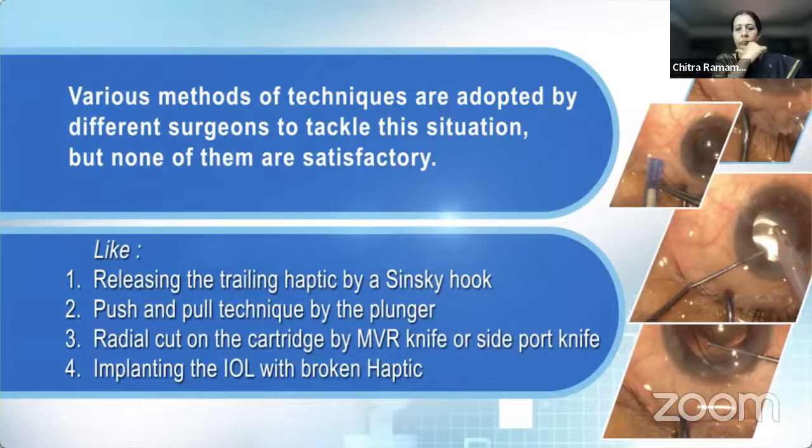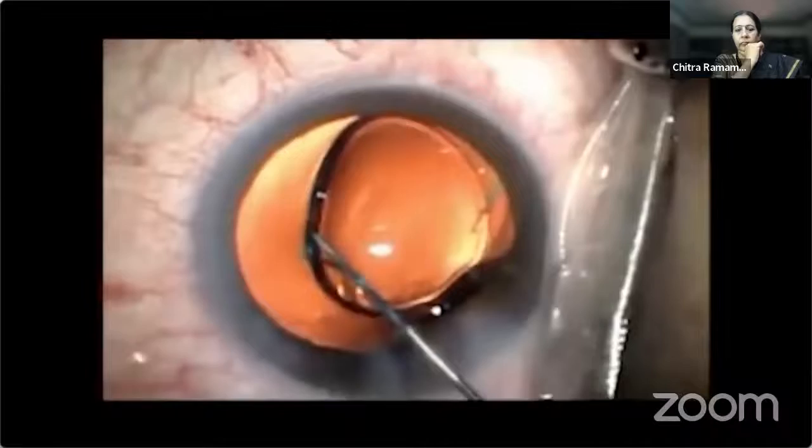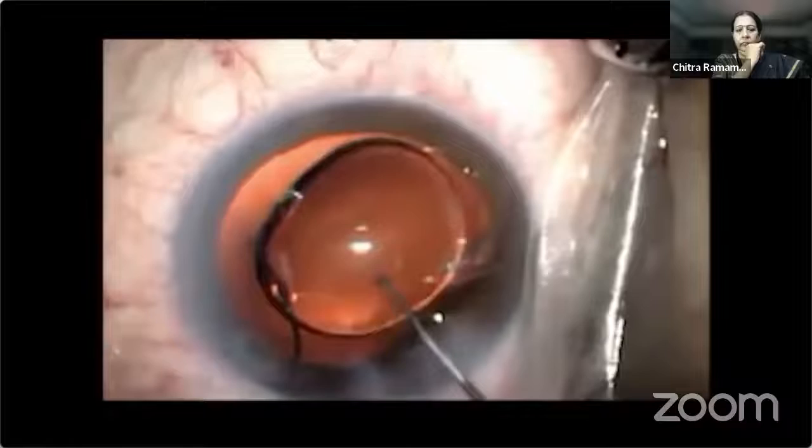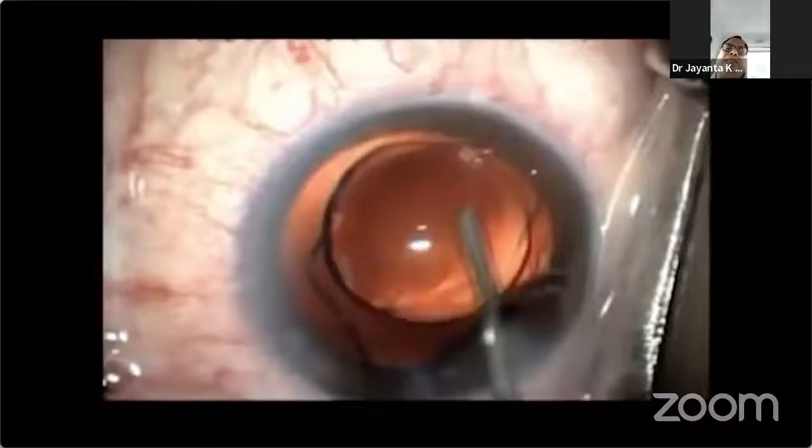Those techniques include releasing the trailing haptic by Sinsky hook, push and pull technique, radial cut on the cartridge by MVR knife, and implanting the IOL with a broken haptic. Sometimes the surgeon compromises by implanting the IOL with a broken haptic, but a broken haptic may lead to significant early tissue reactions, and later the IOL might need to be removed due to decentration.